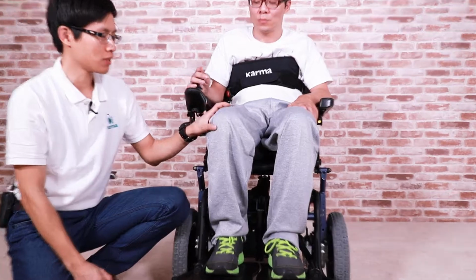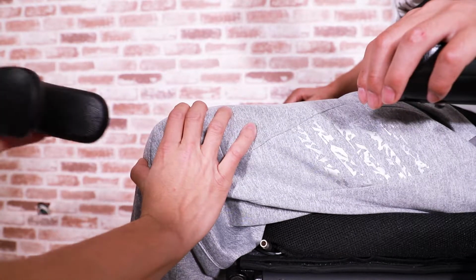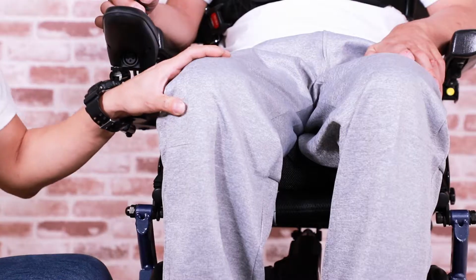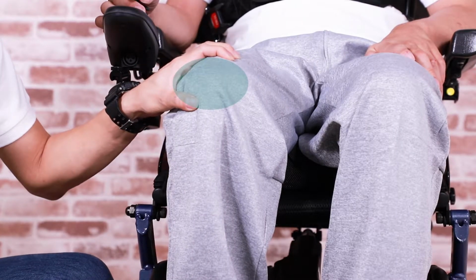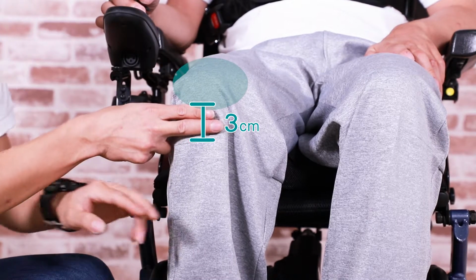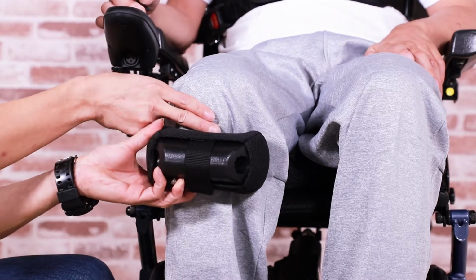How to adjust the knee support? Firstly, we need to find out where the kneecap is. We don't want the pad to be placed directly on the user's kneecap because it will create too much pressure. We hold the kneecap like this. 3 centimeters below the kneecap, which is roughly 2 fingers wide, is the position where we want to place the pads.